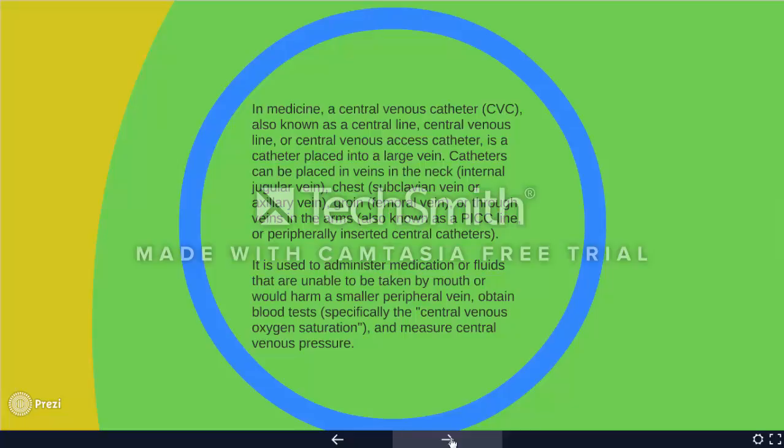It is used to administer medication or fluids that are unable to be taken by mouth or would harm a smaller peripheral vein, obtain blood tests, and measure central venous pressure.